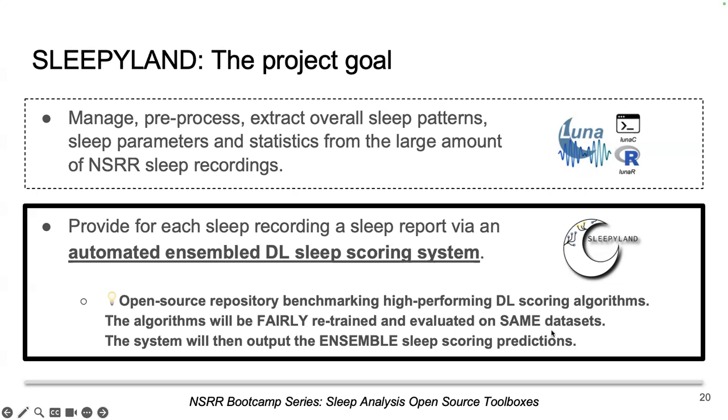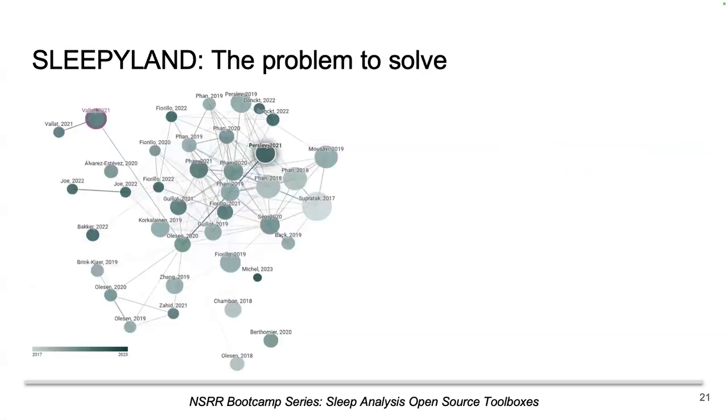So we're using the same set of data to retrain all these algorithms together. And at the end, the system is going to output all the single predictions from the different models, but also the ensemble of these predictions. So this was the main goal of this tool.